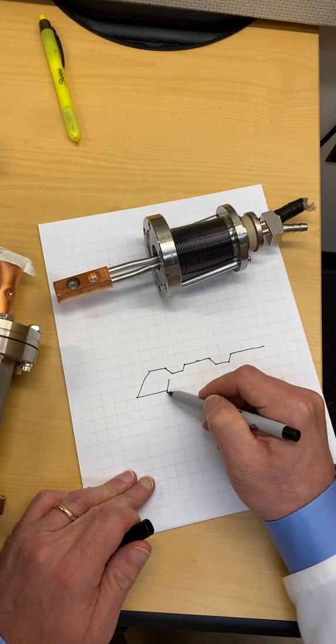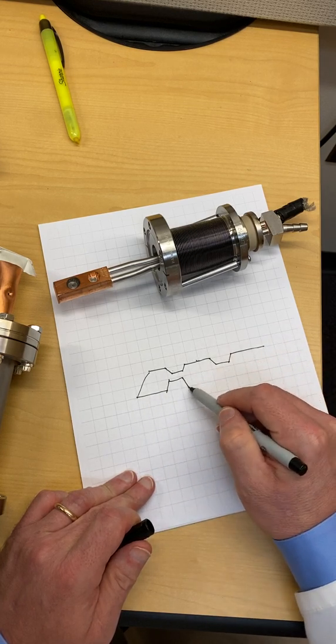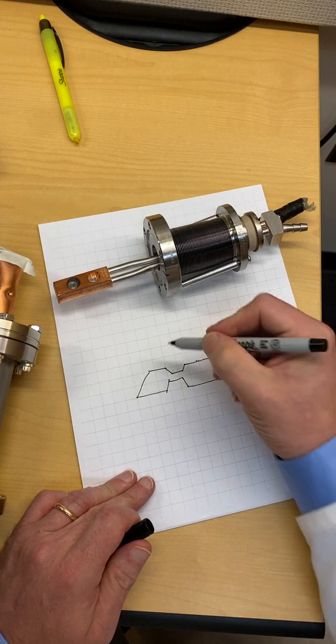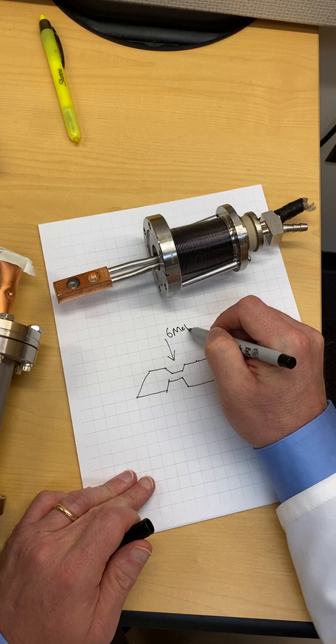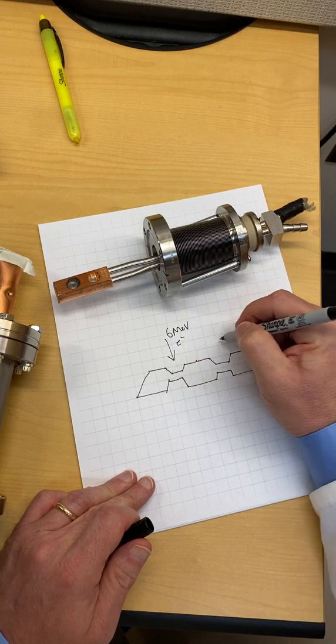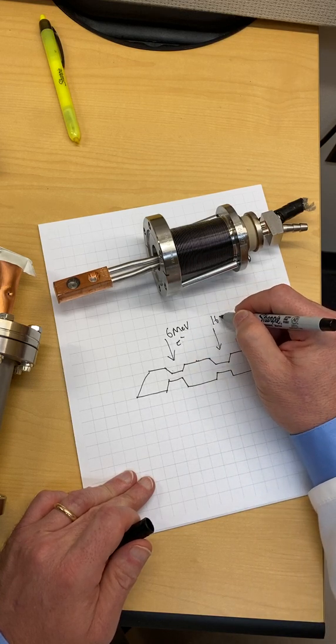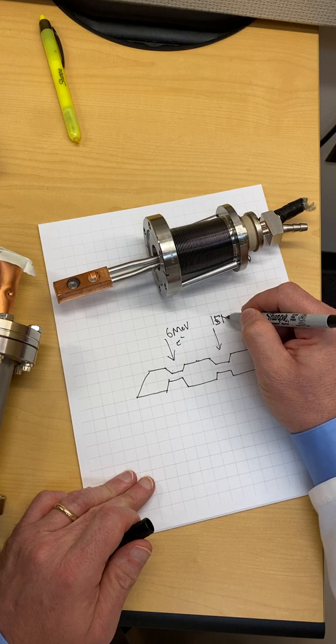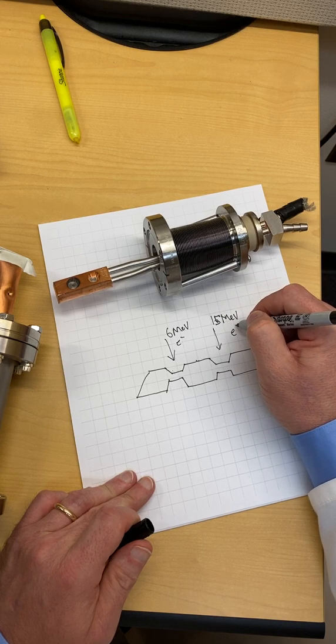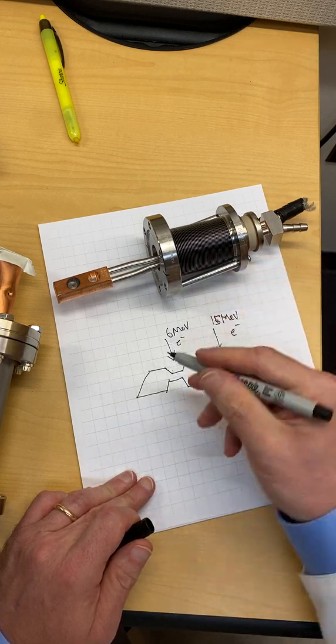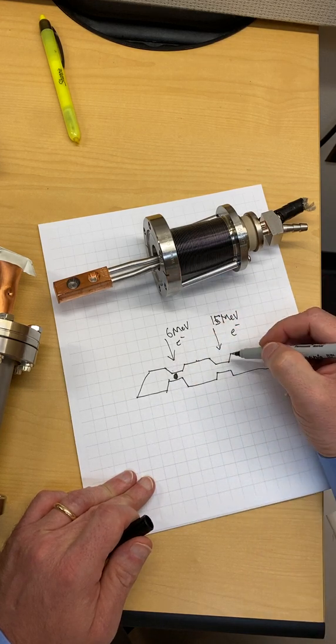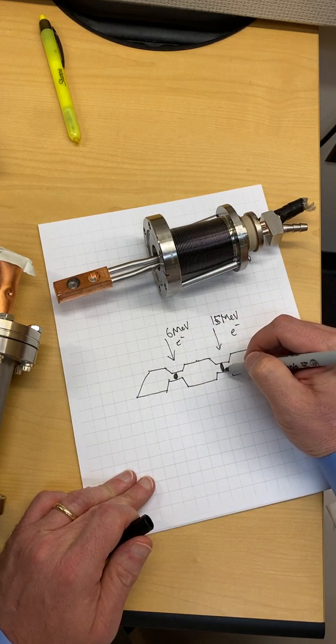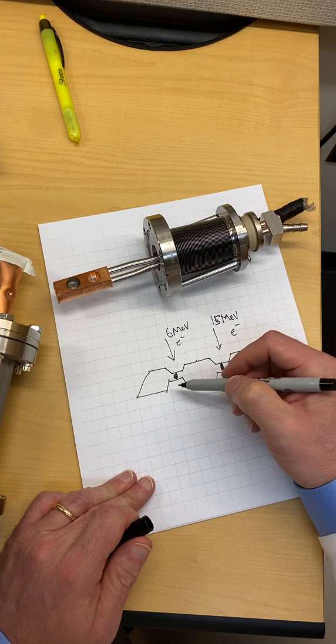So this would be 6 MeV electron beam coming in and this side would have a 15 MeV electron beam coming in here hitting these targets. The electrons would completely stop in here. The 15 one needs a little extra space. The electrons completely stop in there.